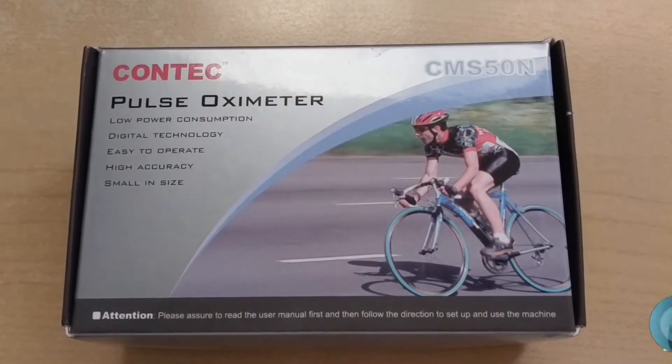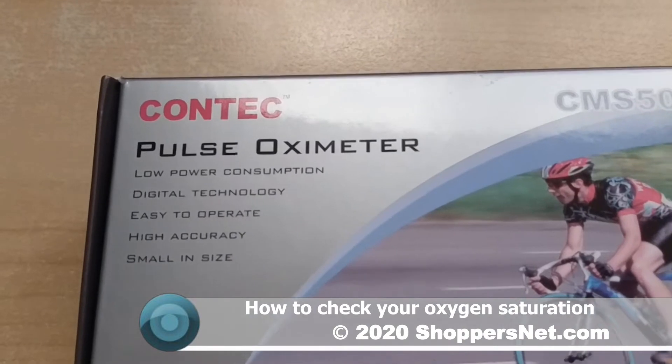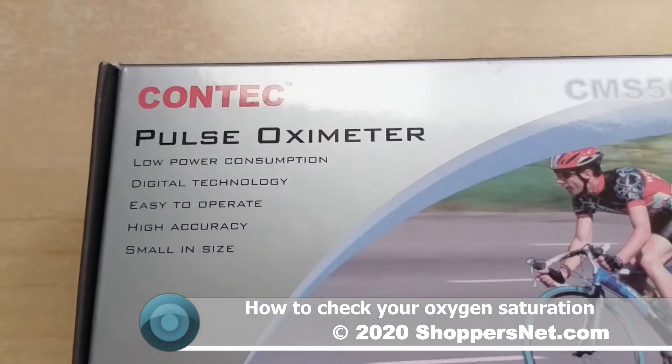Hello Shoppers and Aviators. In this video we'll be showing you how you can check your pulse oxygen saturation percentage, and here we'll be using a pulse oximeter.